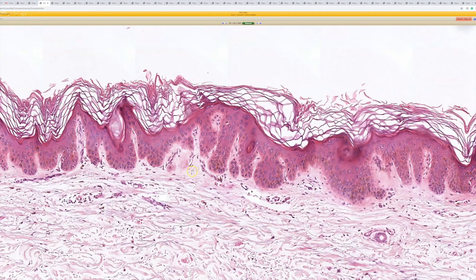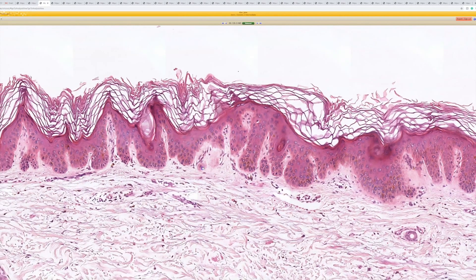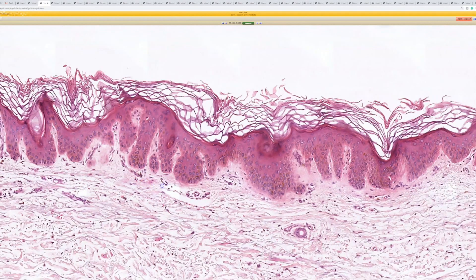What was your initial impression at low power? Some sort of acanthoma — like a seborrheic keratosis, flat wart, or large cell acanthoma — those are all perfect. I'd add solar lentigo to that list. Flat thin sebs and solar lentigos have a lot of overlap; I kind of think they're on a spectrum.